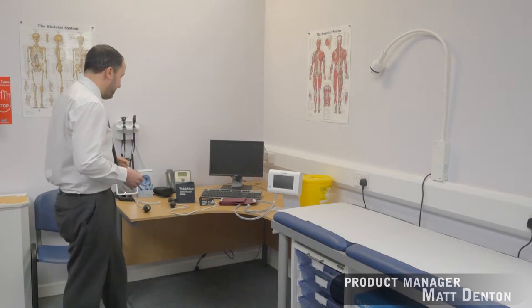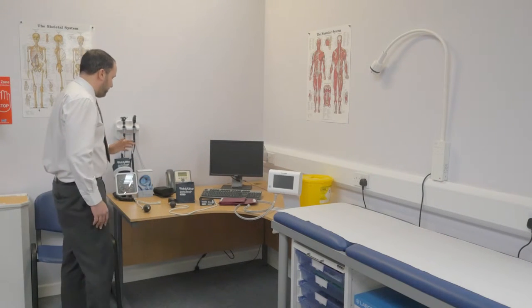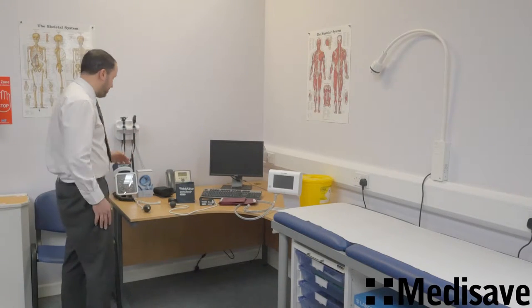Welcome to the Medisave introduction to Flexport Cuffs. The Flexport Cuff is standard across the Welch Allyn range of Sphigs. We've got three different versions of Sphigs on the table here, but as I say, it's standard across the entire range.